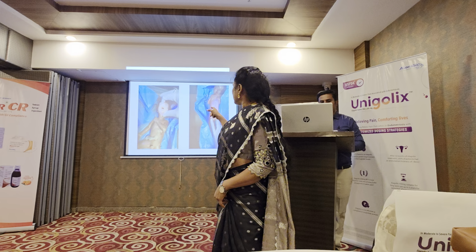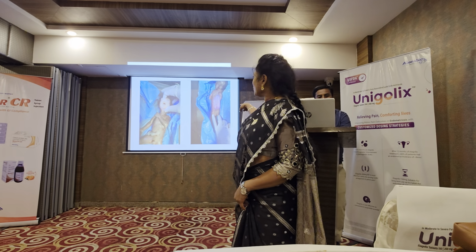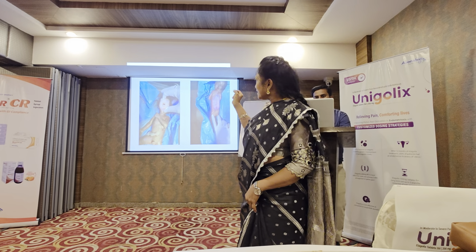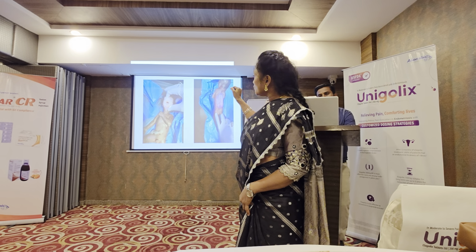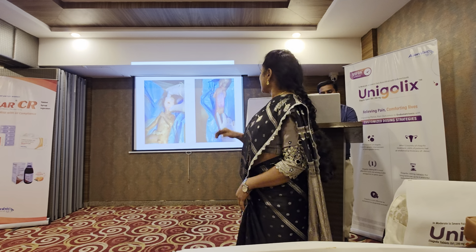Next. This baby had multiple anomalies. There was something wrong with the spine also. So we went for abortion. When we tried to see, there was a cleft deep down inside. Actually, we had to open the mouth and then put a torch and see. Only we could then see the cleft, but it was there.